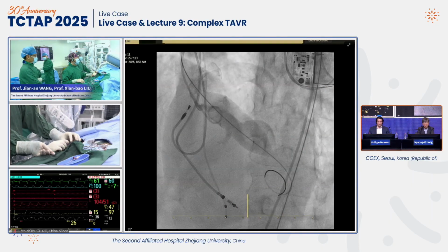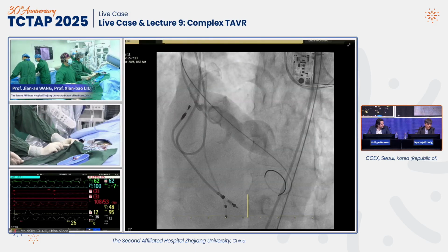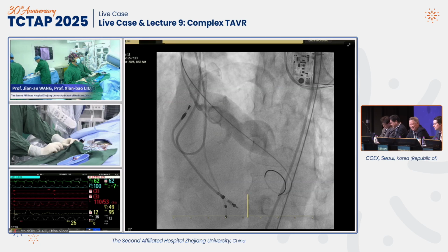26. 26. Very interesting cases. So we are learning high quality cases of the BAV, which is very important. I think the calcium is stronger than I expected. Very interesting cases. I'm sorry, only 10 more minutes left. Okay, go ahead.